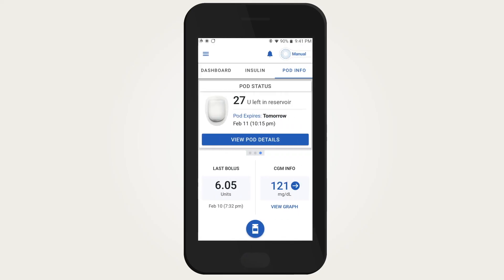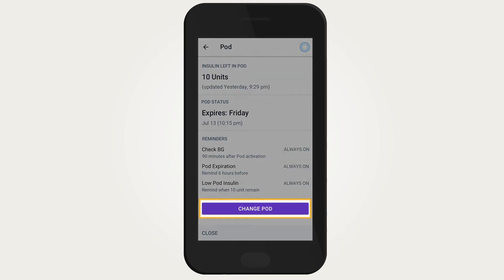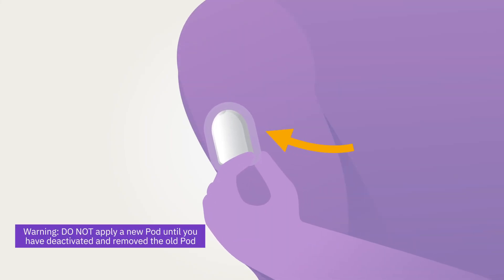To change a pod, you must first deactivate your current pod. To deactivate a pod, go to the Pod Info tab, tap 'View Pod Details,' then tap 'Change Pod,' then tap 'Deactivate Pod.' Remove the pod slowly to avoid possible skin irritation.